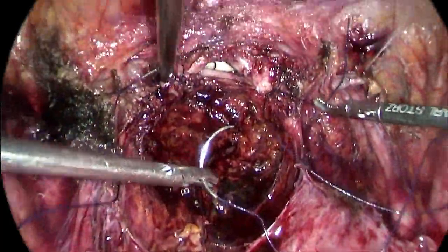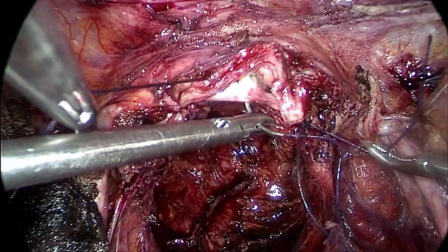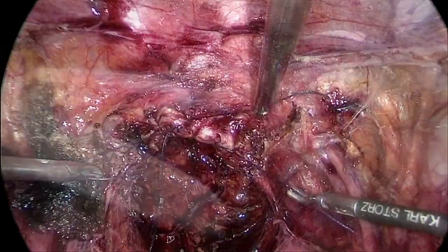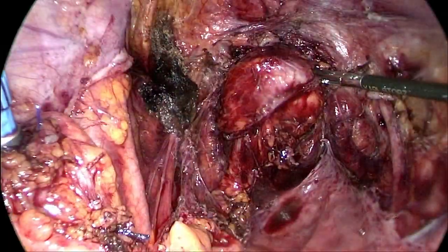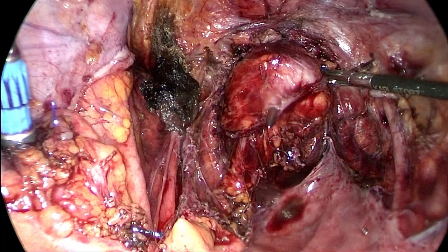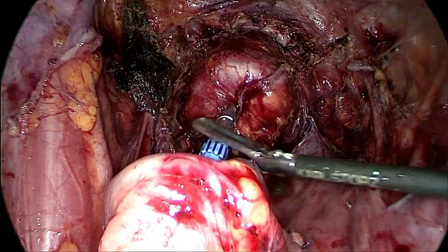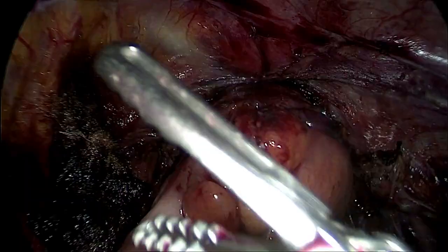The surgeon then sutures the vaginal vault with polyglactin 2.0. After transanal passage of the circular stapler, the colorectal anastomosis was performed 5 cm from the anal verge.